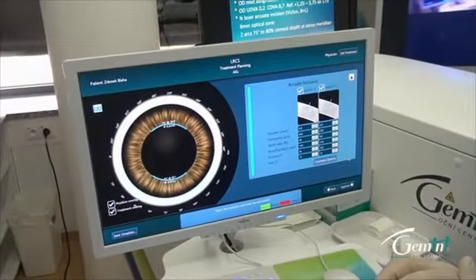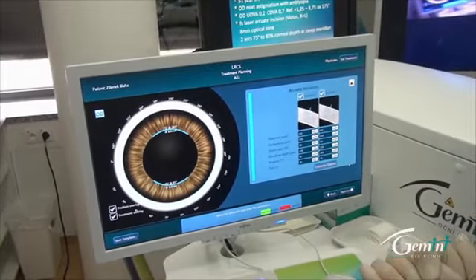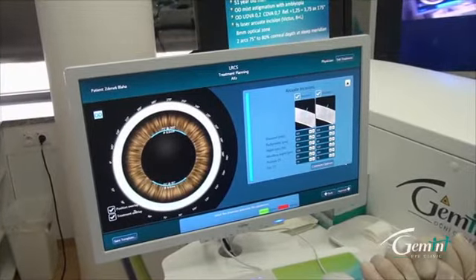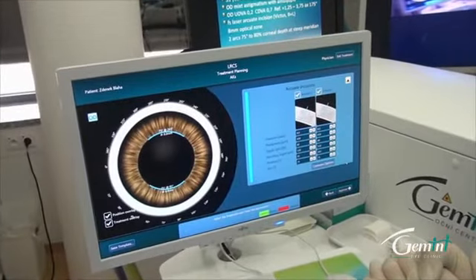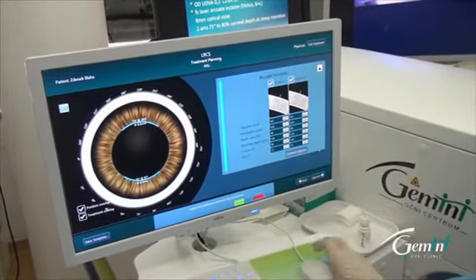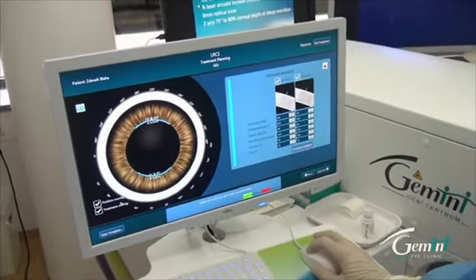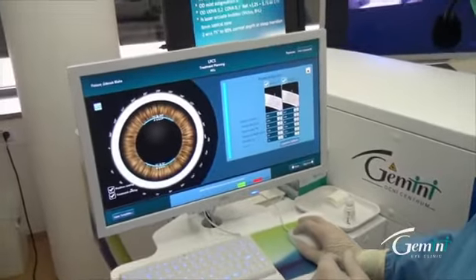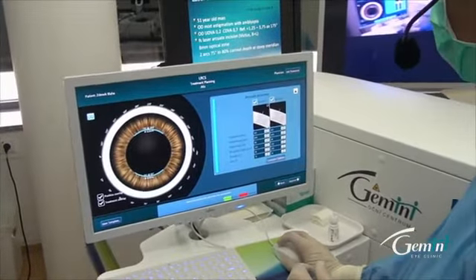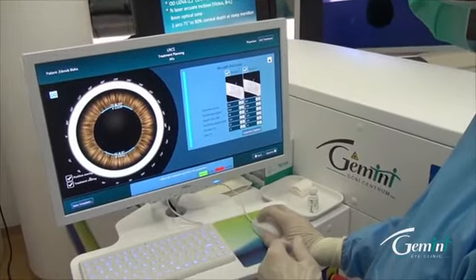So all those parameters are quite safely set for those corneas, and we believe to achieve really nice two cuts. We can also change the depth of the cuts or the parameters, whatever you want. You can return it, so it's all free planning here.